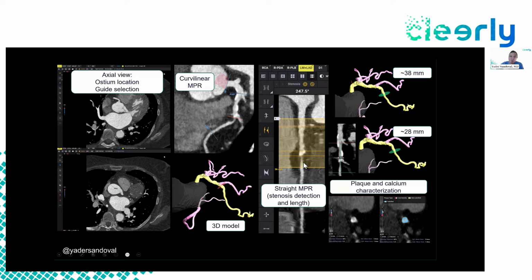And now, critical, as I said before, a particular piece of information that is very important for us is case complexity. So now if we go to the lesion, do the plaque overlay, as you can see, that plaque overlay as compared to the last case that was a yellow lesion circle non-calcified, this is a blue donut. This is a very severe concentric calcification. This is now different. So this case now needs to be done at a primary cath lab that has calcium modification strategies to deal with this calcium, somebody that's comfortable with bifurcation coronary disease, and you need 2 wires.